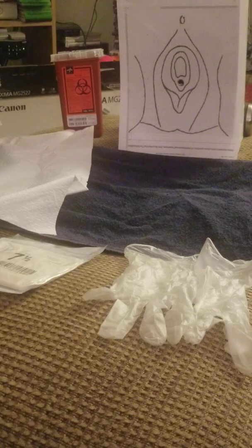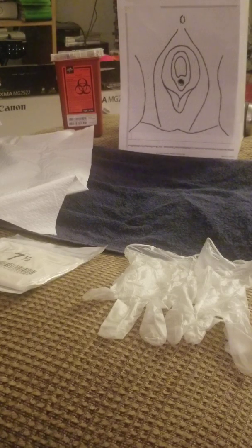Hi, my name is Shakaya, and I am the nurse that's going to be performing a catheterization on my female patient, Mary Smith. I'm going to be reading a little bit slow and going a little bit slow just so you'd be able to keep up with me and everything is in order. The first thing I'm going to do, obviously, is assess the physician's orders.